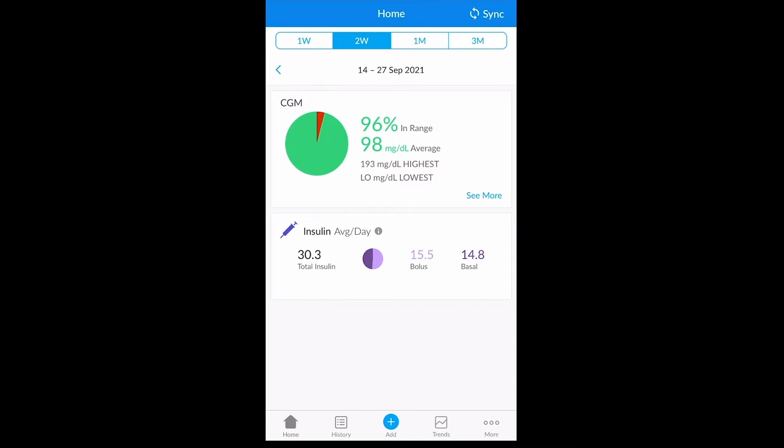In order to pair your device with the Gluco Mobile app, first navigate to the Sync option in the top right corner.